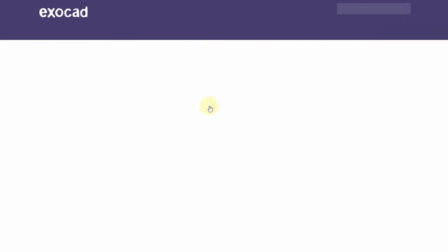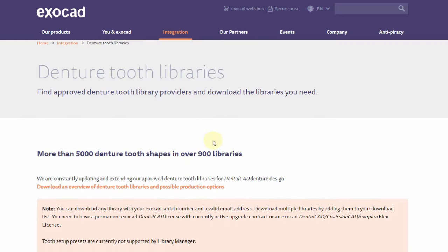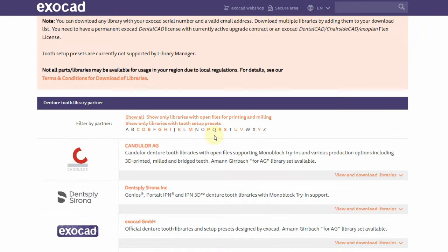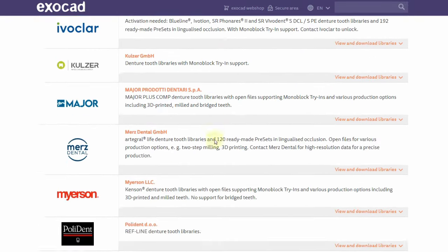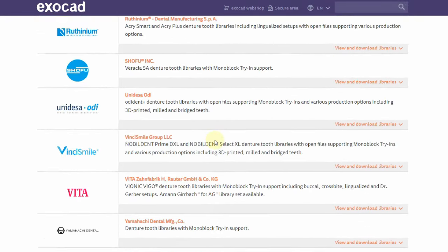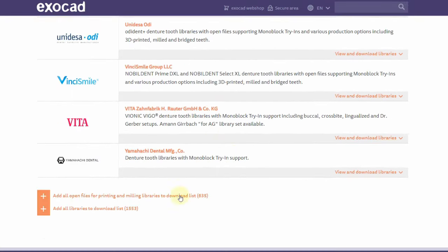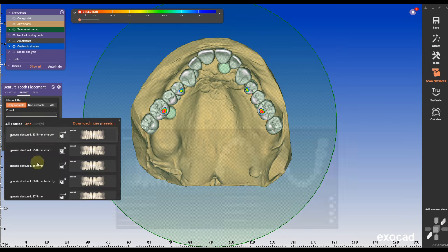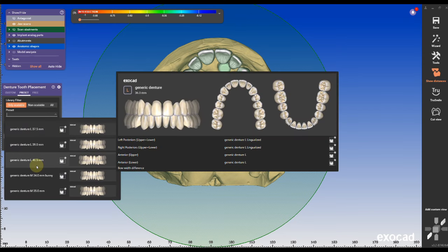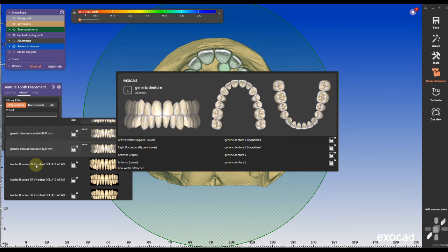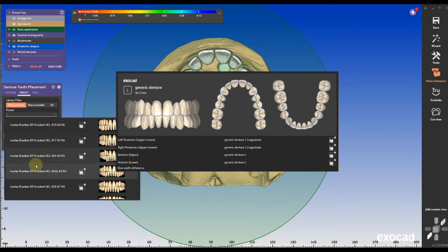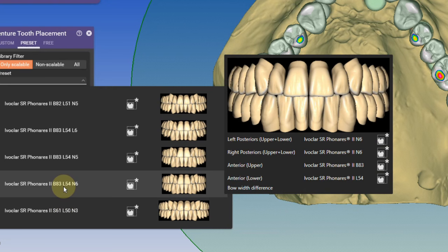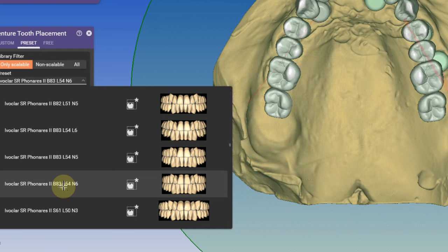Exocad has a couple of denture teeth libraries already preloaded but you can download more for free on the Exocad website under denture tools library. Download all will get you the entire array of denture teeth except Ivoclar. You must purchase a special license from Ivoclar. Favorite ones from Ivoclar are the Phonares teeth because I like them because of the texture and the anatomy of the teeth.